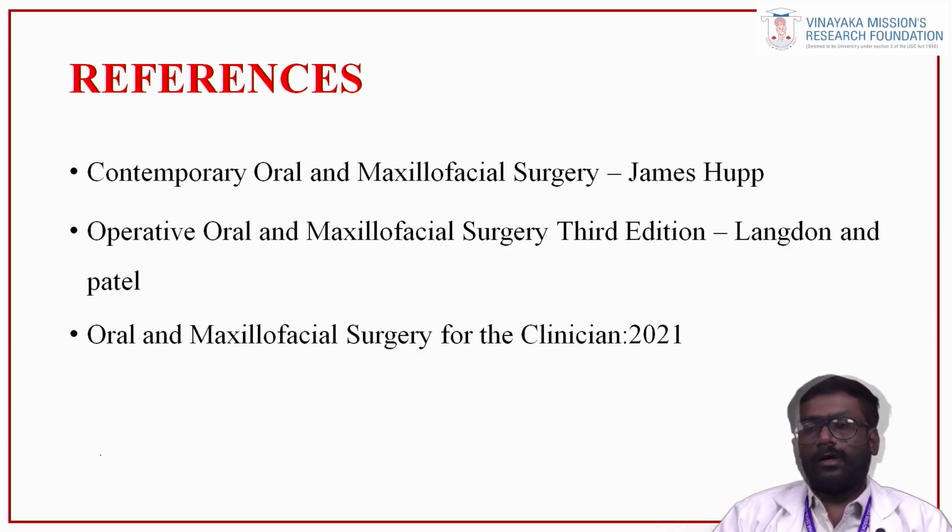And then you can use an appropriate root end filling material, either MTA or Biodentine, which is recently gaining popularity with good biocompatibility and these advantages. So you create a cavity in the root of adequate size, parallel to the canal walls; the endodontist would be the best person to tell you about this. Once that is done, the root end filling material should be filled. That has to be verified in the radiograph for adequate sealing and adequate filling.